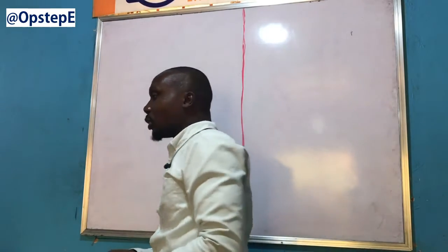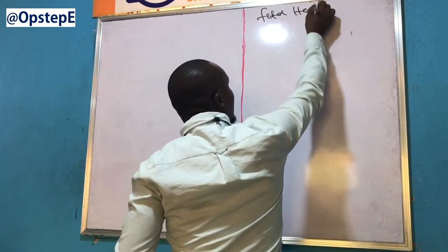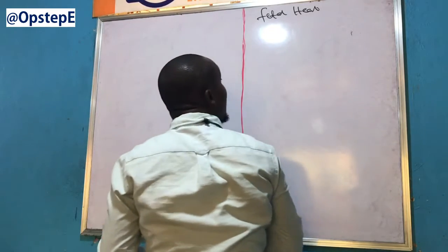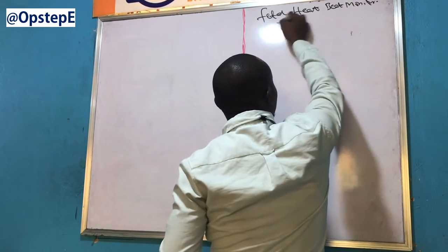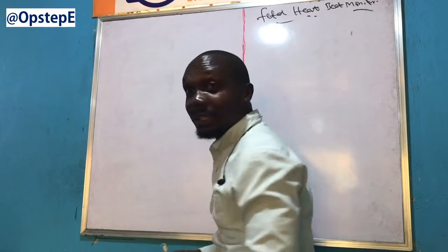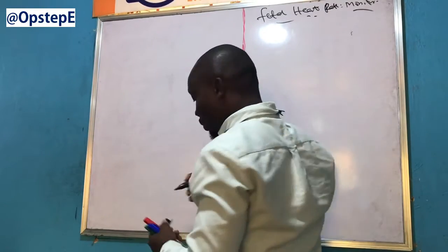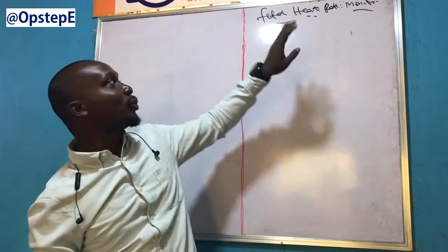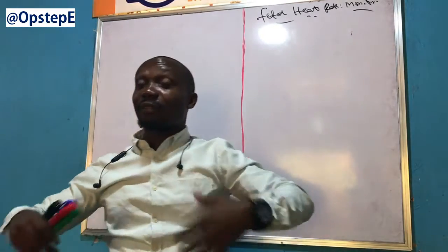The project in question is a fetal heartbeat monitor. Heart rate monitor. So the essence of the project is to first, of course, if we have to go by the definition of what we have on board, we say fetal, it's called fetal, sorry.